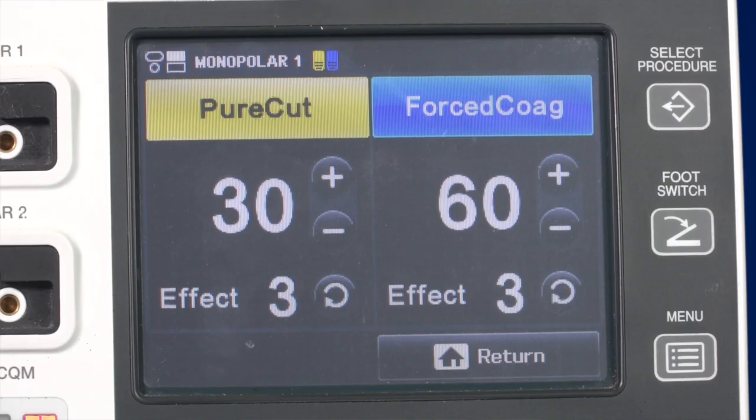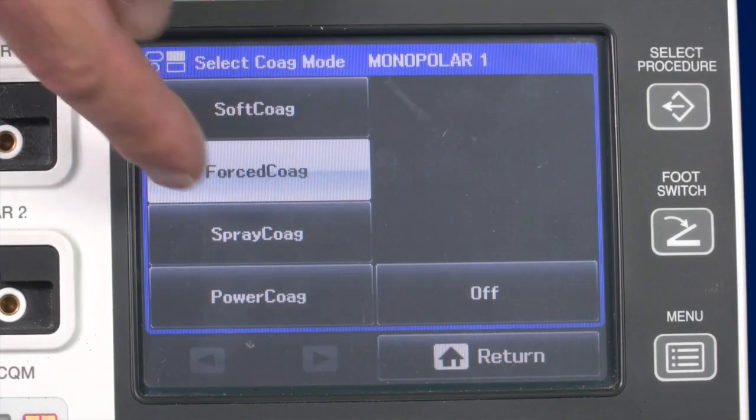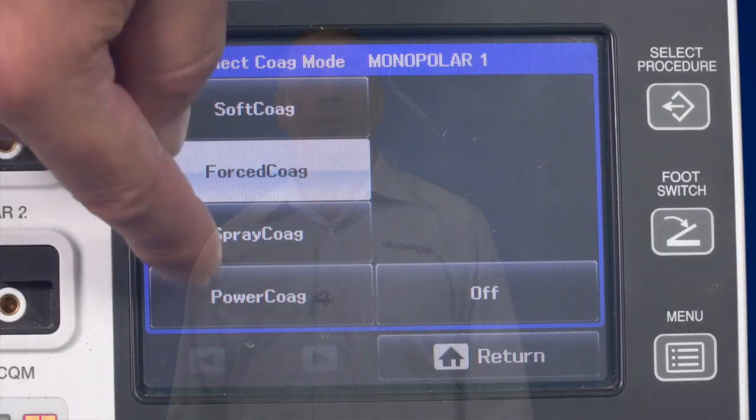There are four monopolar coagulation modes: soft coag, force coag, spray coag and power coag. The soft coag mode is the standard mode and produces almost no tissue carbonisation; it is suitable for deep coagulation achieved by the use of forceps.